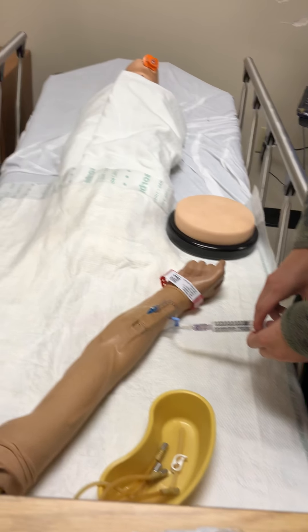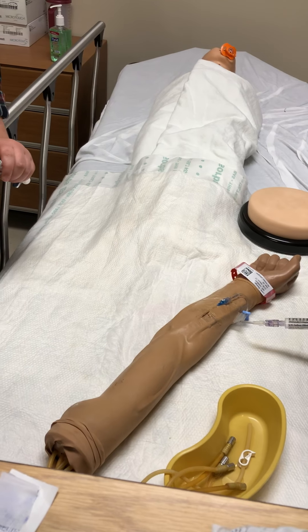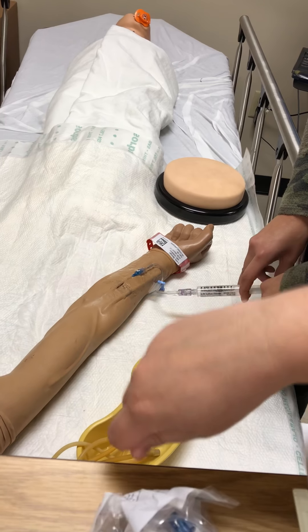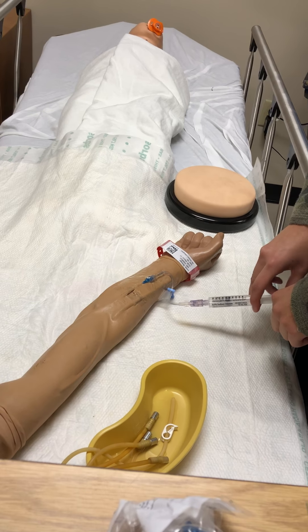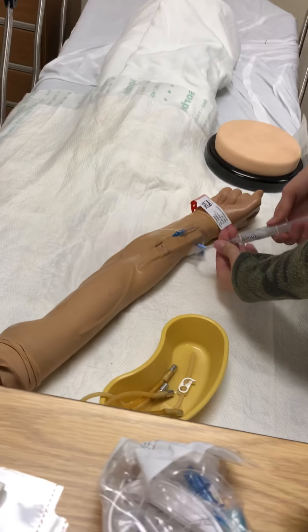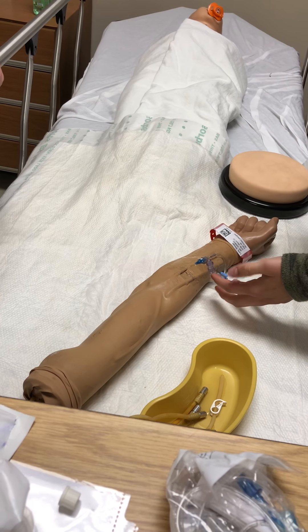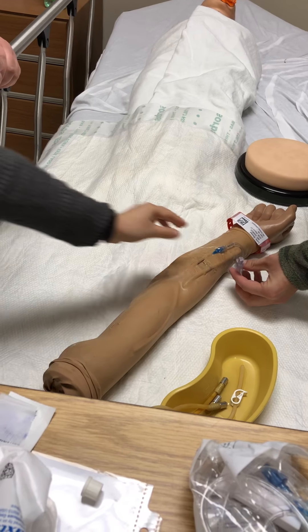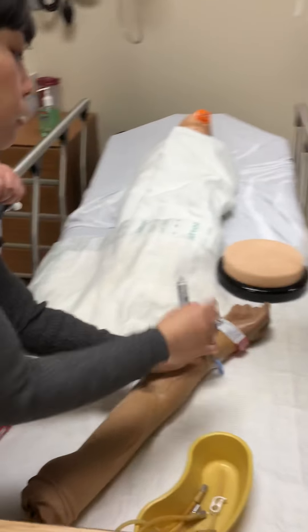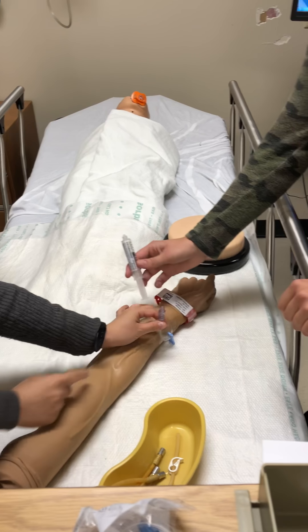For prep, do we grab two then? Because you said we have to flush before, then administer the medication, then flush again. No, you can use the same one as long as you don't put it down. Yes, you can use five mil before and after — so it could just be one. Recap it? Keep it, so that it can't touch though. You can keep it here, and then do them. As long as it doesn't touch — nothing touches.